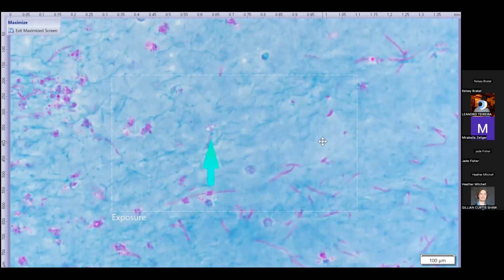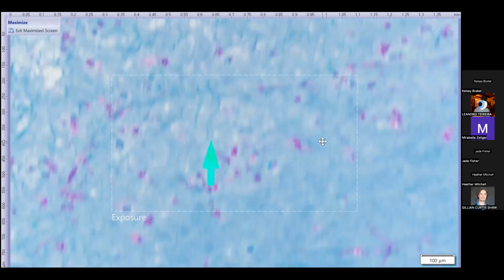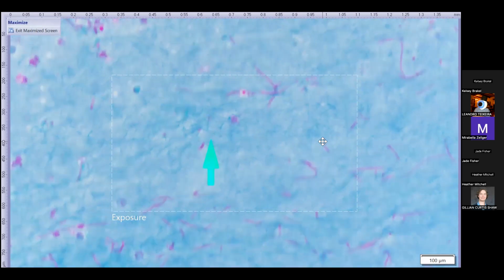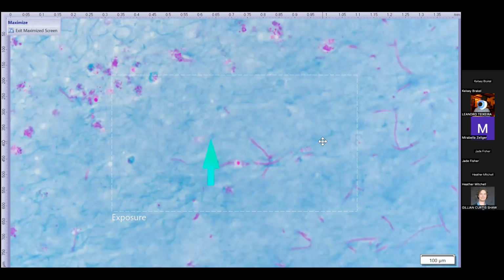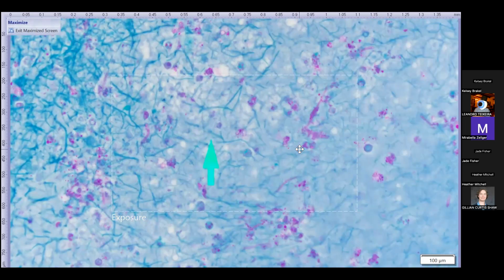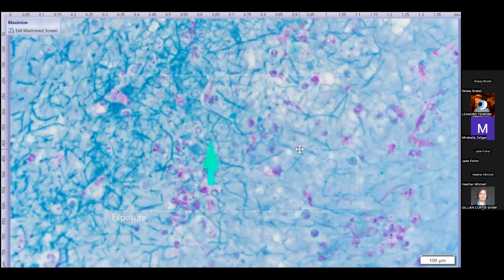And then occasionally I was able to find sort of right angle, non-dichotomous branching, like that guy. Oh, wow. Like maybe this right here. And then, as I said earlier, the fibrin, which can sometimes mimic fungal hyphae, does not stain with the PAS stain. So all of that green fibrillar stuff is actually the fibrin.